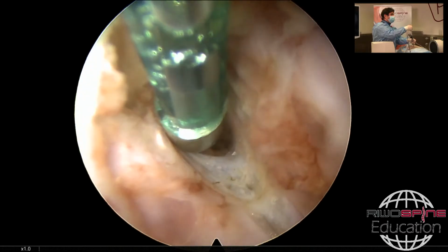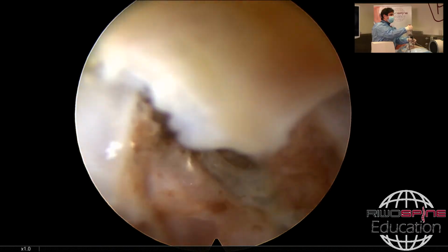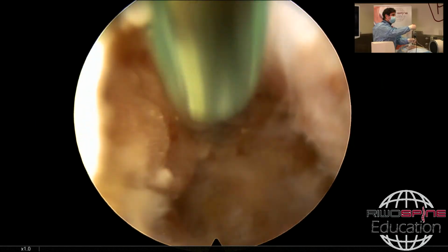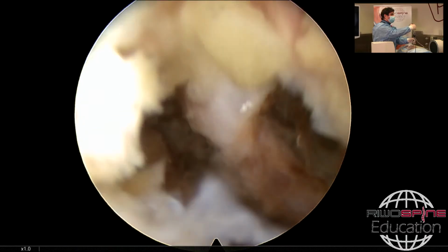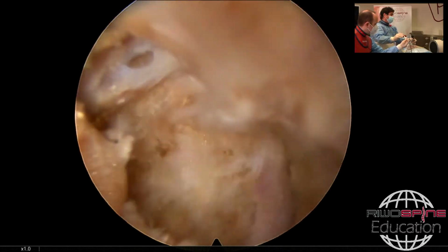You can explore the axilla like that. You can do this only with the 4 megahertz radioablator. It's too much with the conventional bipolars. Then you can reach more. And the importance of this, also we see what we are doing.